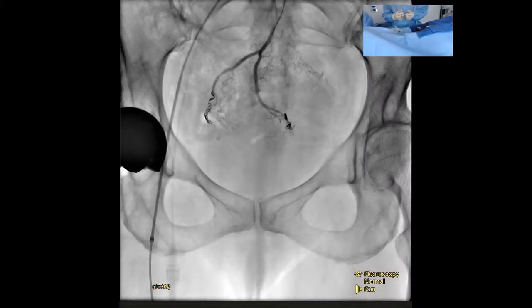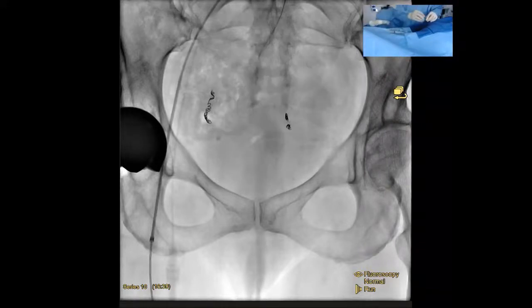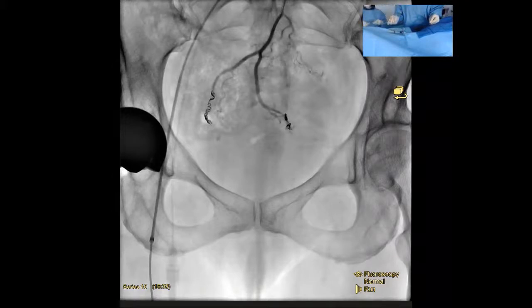That's our completion run here. You can see we have greatly diminished vascularization here towards the rectum. But I tend to work in this projection. It's fairly obvious to see. Now, if I'm on one side and it's my last vessel, of course, then I'll go to an oblique projection and look for something else. But you can see here, this is what we'll typically do. In a case like this, without a large middle rectal inflow, we won't typically examine the internals.